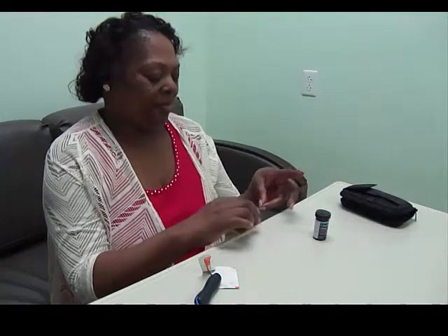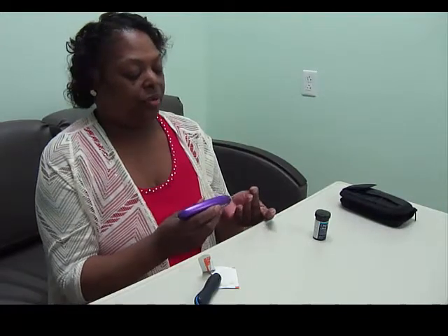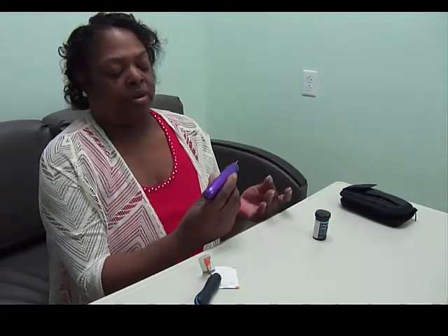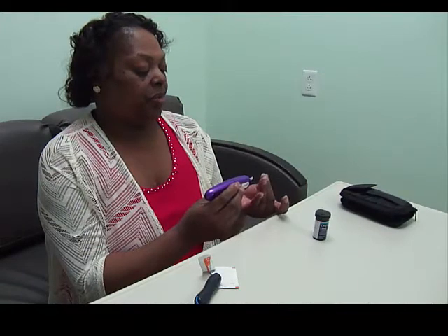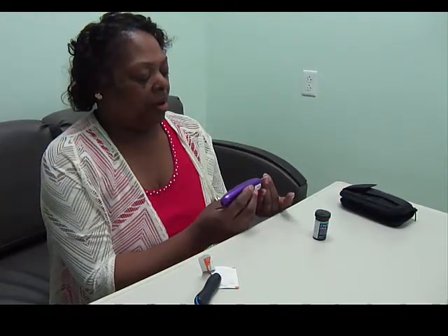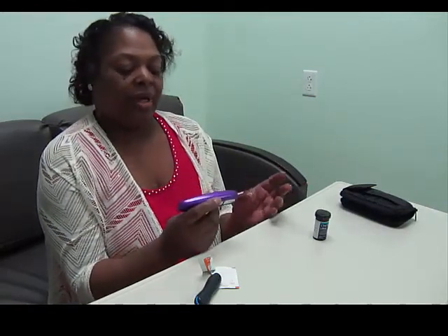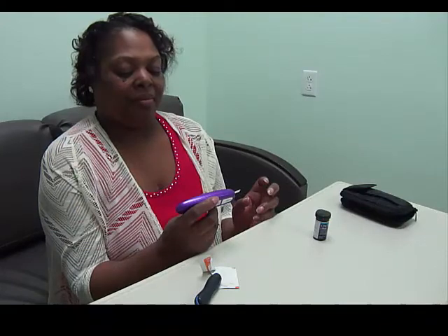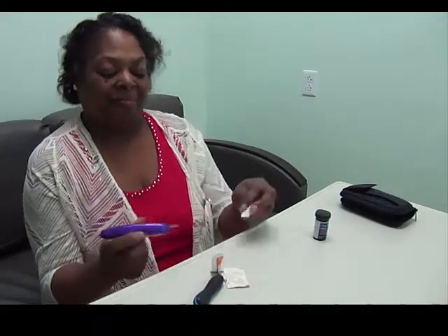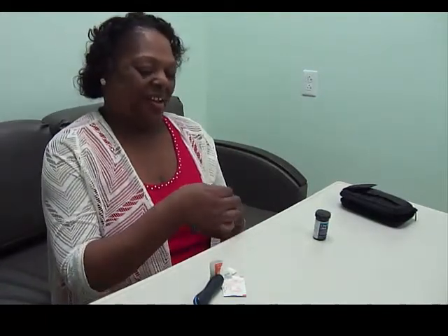Now, put my strip in. It doesn't take that long to read, and you wait for your little prompt to come up showing that you need to put some blood on there. And it'll start reading. Okay, 168. So that's pretty good since it's noontime, after lunch.